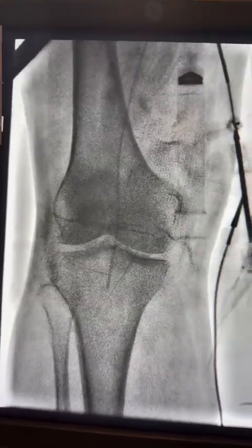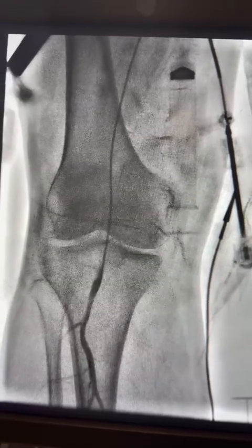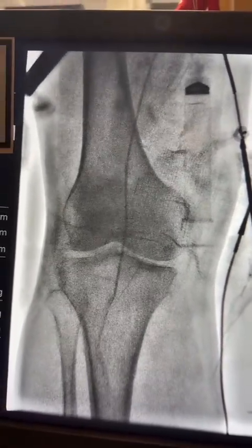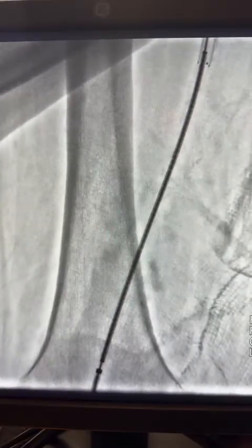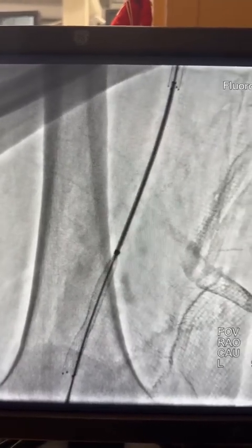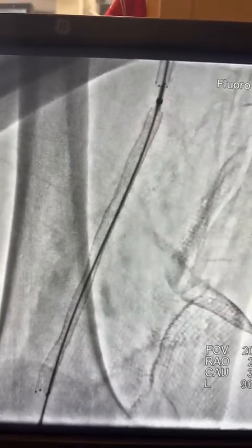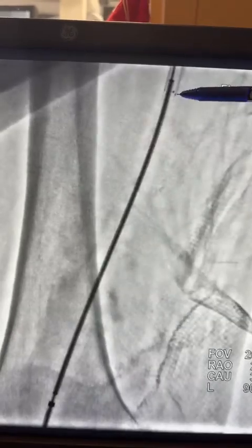To confirm we are in the true lumen after advancing the glide catheter, I injected distally — and you can see we are in the true lumen. I also gave some intra-arterial nitroglycerin. I then used a drug-coated balloon, first 5mm, and then overlapped the stent with another Boston Scientific Eluvia 6mm stent, which landed perfectly distally.